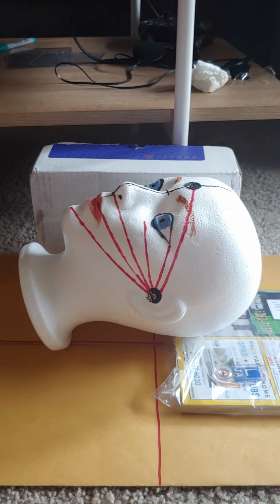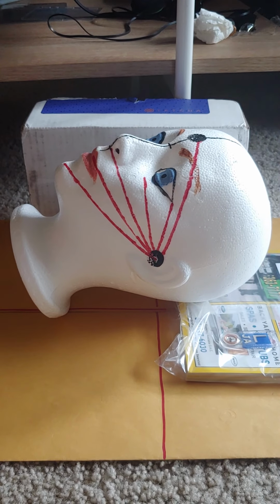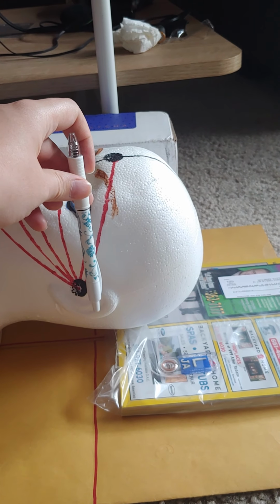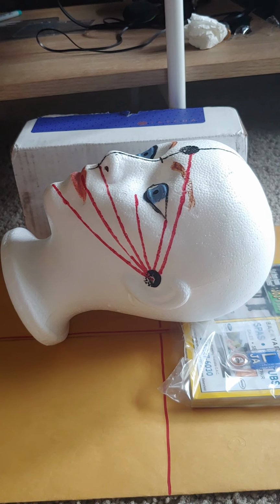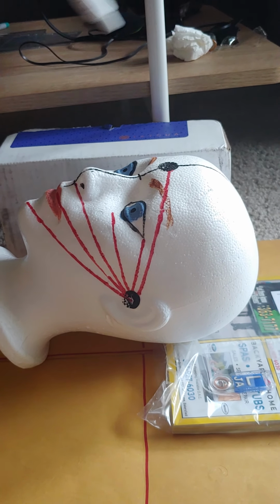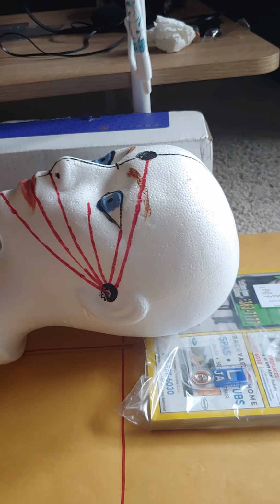This is my AP skull, no angle. For this, you want the MSP perpendicular with the IR, and you want the OML perpendicular. I tried to make it as perpendicular as I could. The central ray is perpendicular. There's no angle, so it goes down like this. And then the CR entrance point is at the glabella, so right about there.